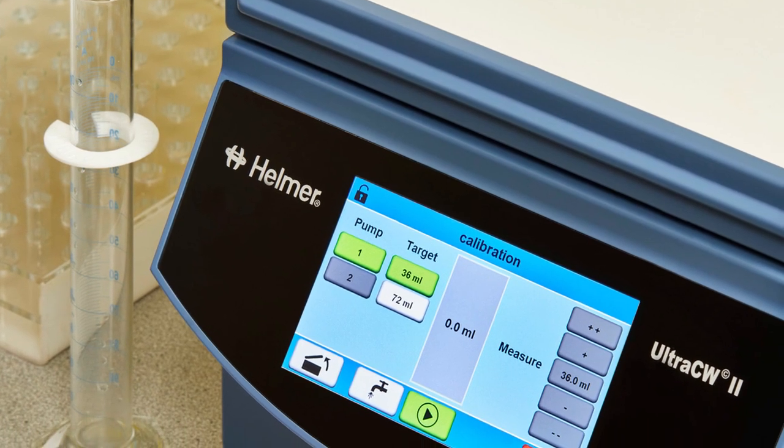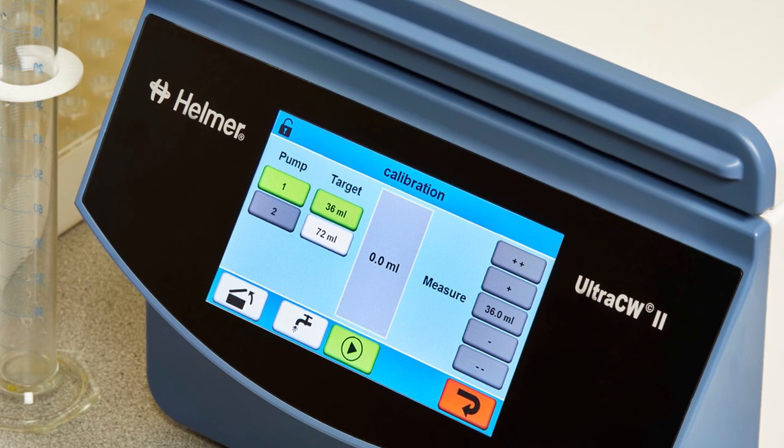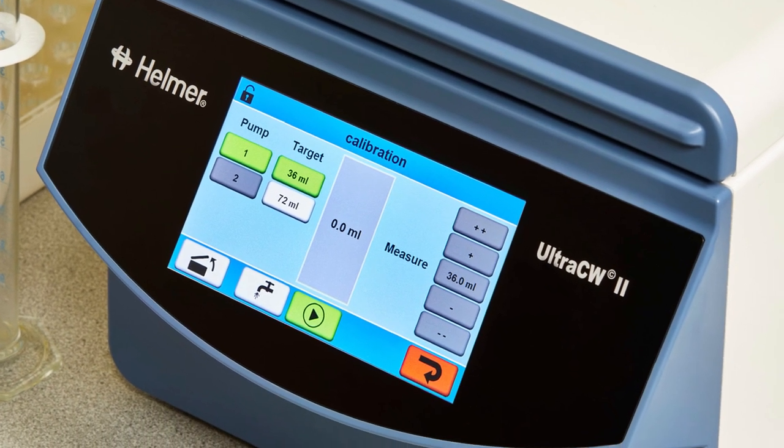This video provides a demonstration of the system settings and calibration for the UltraCW2 Automatic Cell Washing System from Helmer Scientific.